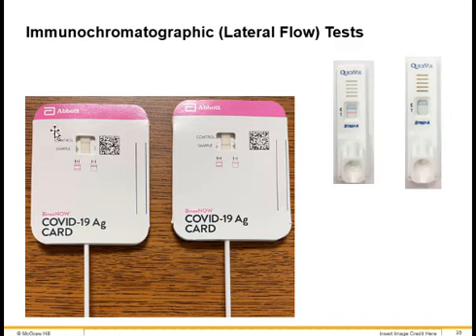So this is very similar, and if you haven't seen the Binax kits, inside there is this little strip of paper, and you put the reagent on the paper. It's like 6 drops or something like that, and then you swirl this little swab in here 3 times, something like that, and then you close it and the two things come together.